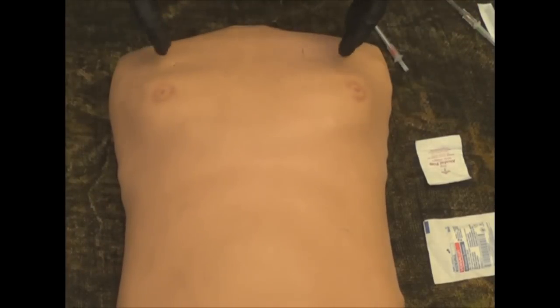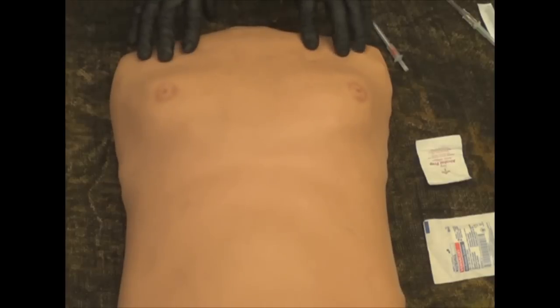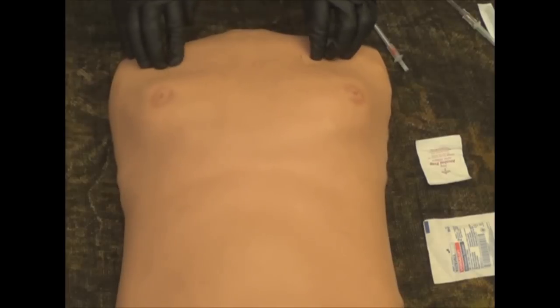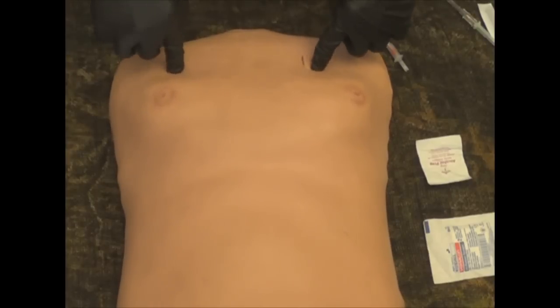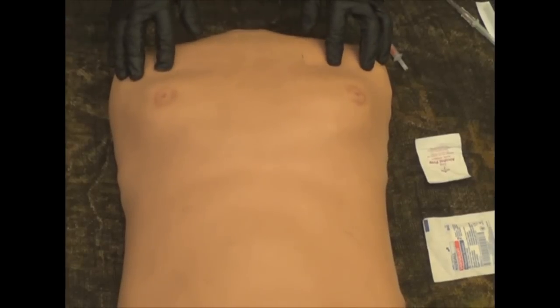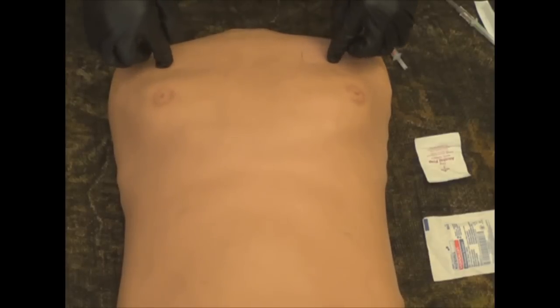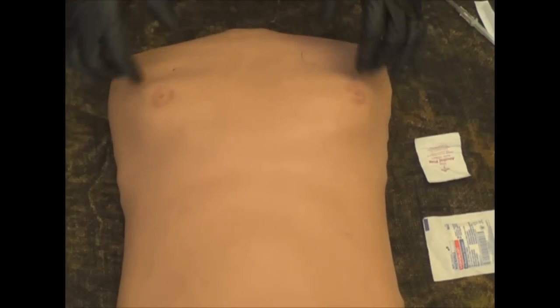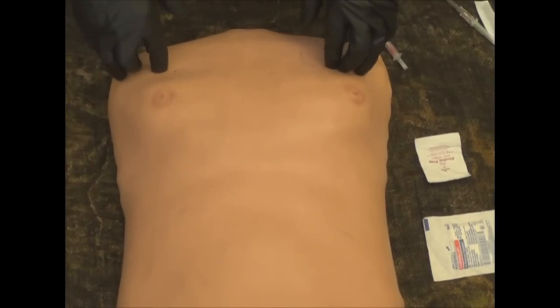Typically what you're going to see is the second and third intercostal space. Remember that your clavicle — your collarbone — is running here, and your first rib sits just under that. So you've got your second rib, and here's the third rib. We're going to insert the needle. The collarbone actually runs from here to here, so we can come a little bit over on our patient and pleural decompress. Remember: go over the top of the rib, because up underneath the rib you have vasculature, and we don't want to create even more bleeding or trauma. So second, third — and go over the rib.